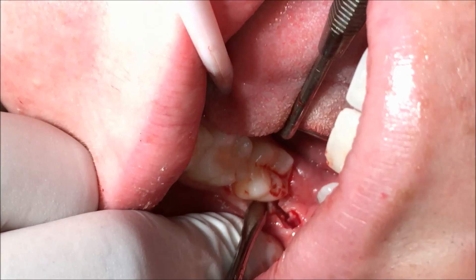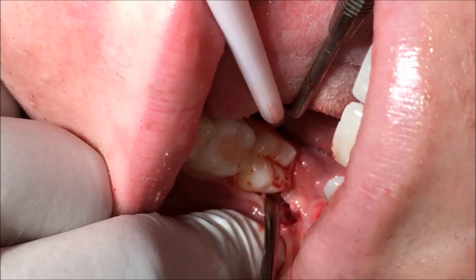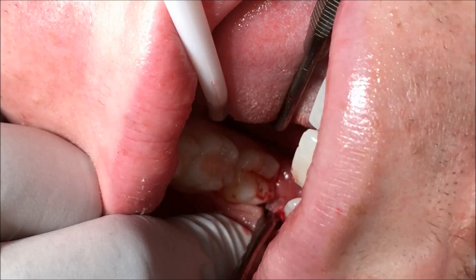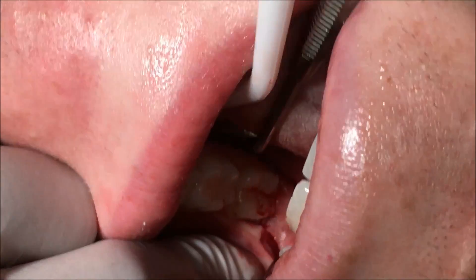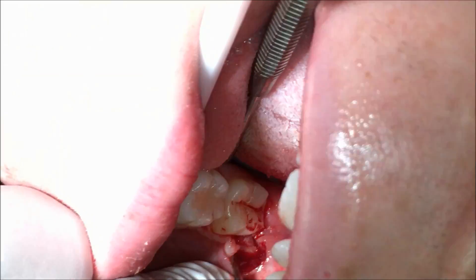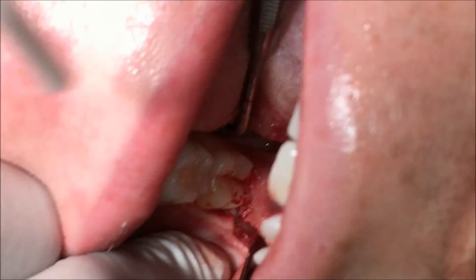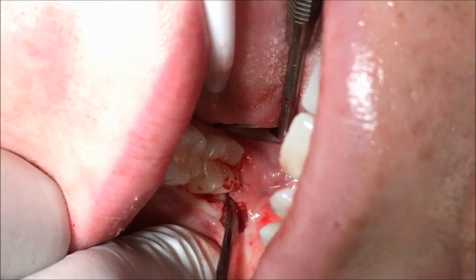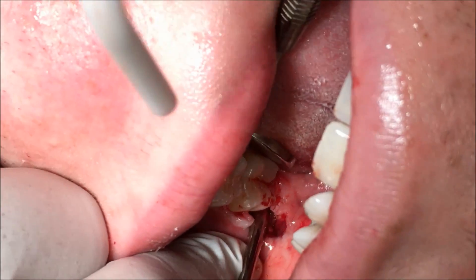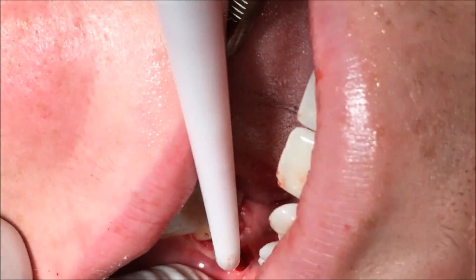We're just elevating the flap now and that will expose the underlying bone. When we're elevating the lingual bit, it's important to stay on bone because of the lingual nerve there.